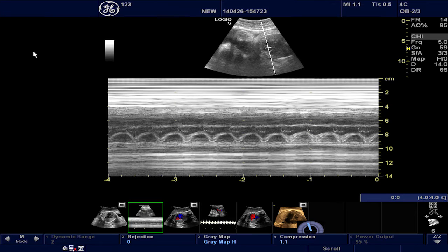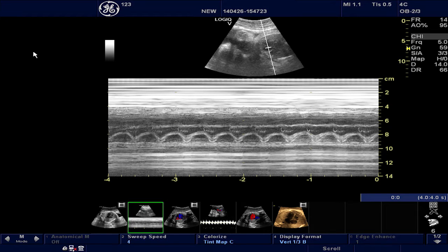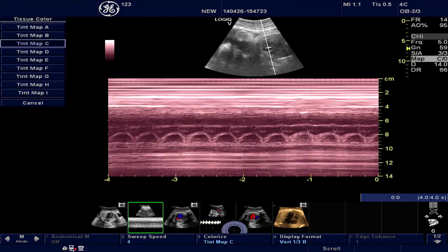Now you can optimize the image similar to how we did for the B-Mode image by changing gray map, M gain, and compression. The user can also colorize the trace by using one of the color maps available, if desired.